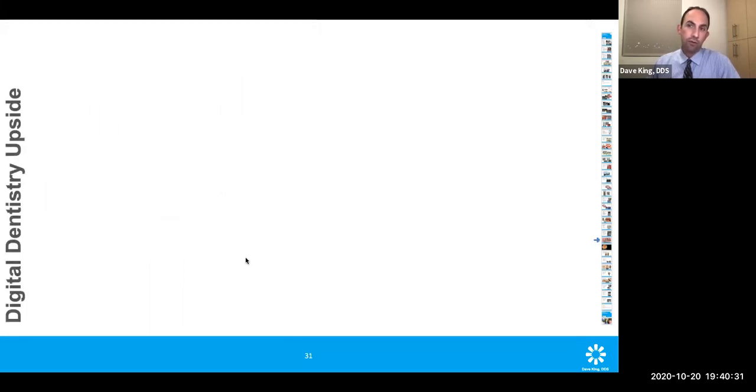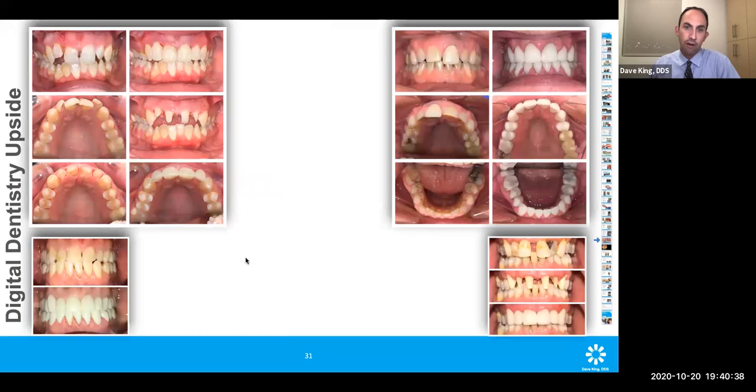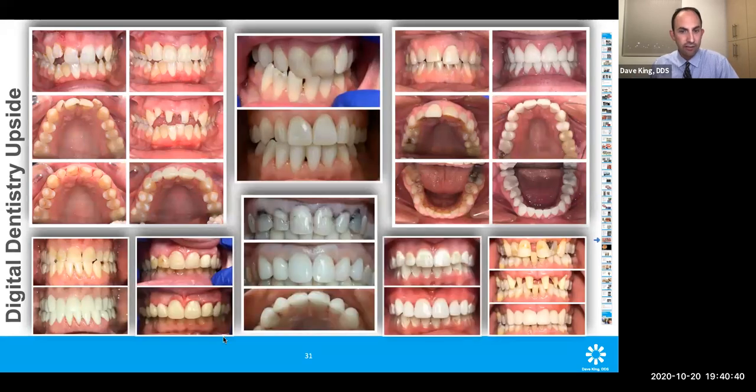So, quick break from implants. Let's talk about digital dentistry. Many of you are very familiar with some of the things that digital dentistry can do. All of these cases that you see here are cases that I've had an opportunity to do in a single appointment in the dental office with CEREC. So mostly smile makeover stuff is what you're seeing here.